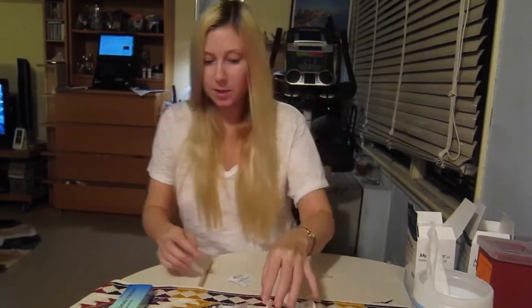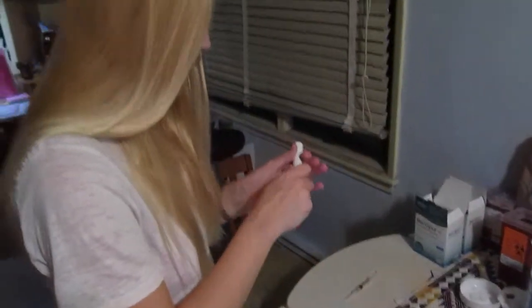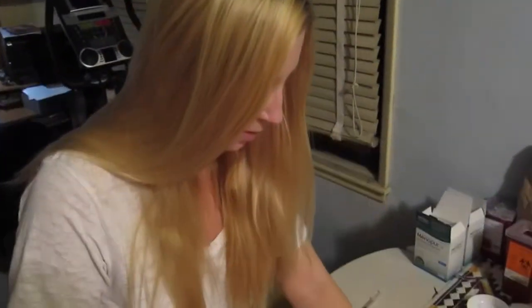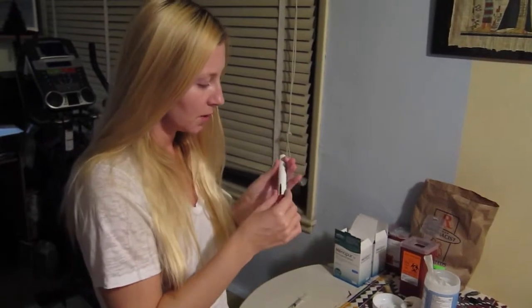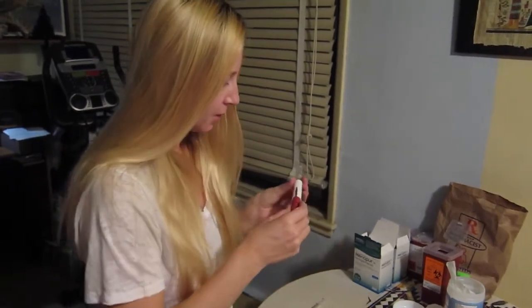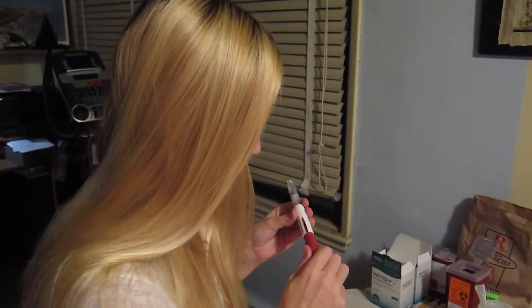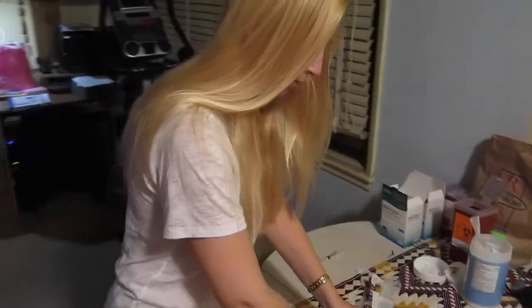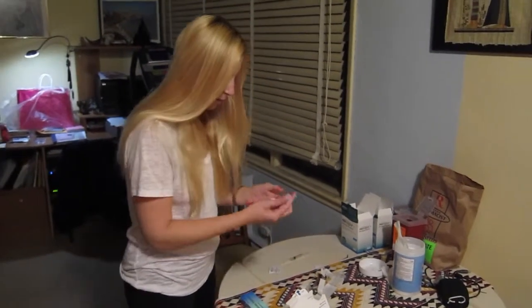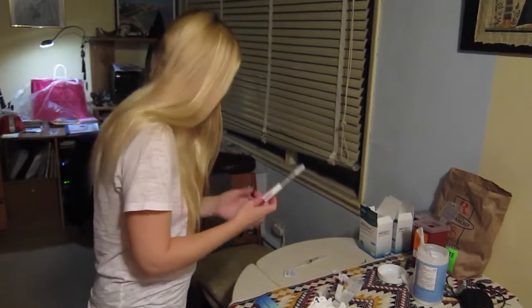The second shot I have to administer is Gonal-F, and it has to be kept in a fridge. It's a pen. I keep it in the fridge and I have to administer about 300 units. So I just rotate the pen dial and it will give me 300. When I reach 300 I adjust the needle, peel off the top, and screw it in. This one is ready.